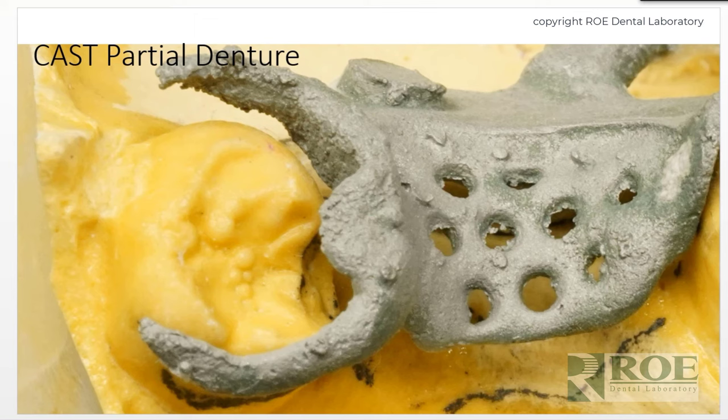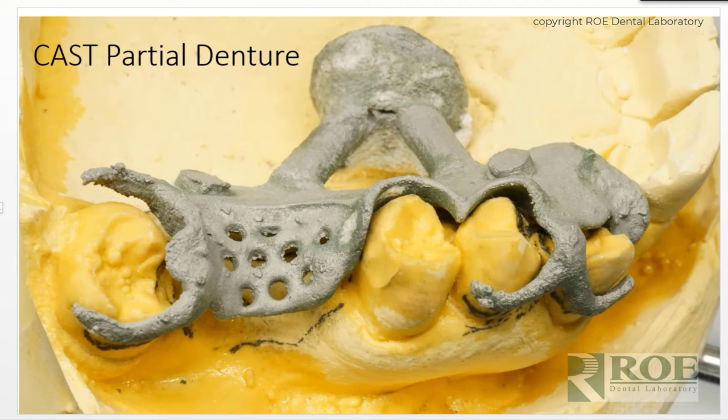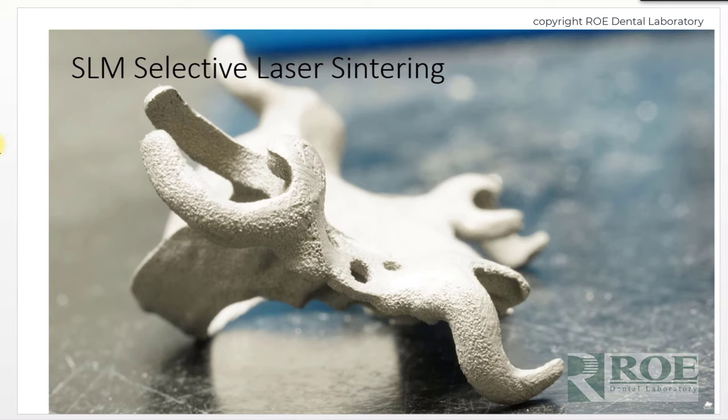In fact, this is what a casting looks like when it's done traditionally. A technician has to take the case and grind off all of the surface carbon, all the surface material, and try to smooth it. Just look at the inside of this clasp and underneath this rest seat, and imagine taking a burr or any kind of grinding tool and trying to make that ideal to fit a crown. Not impossible — we did it for decades — but that's what a partial looks like coming out of investment.